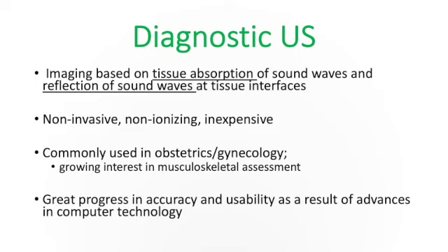We're very commonly aware of this in the context of OBGYN. Obviously, this is a nice way to view what's happening with a developing fetus. And what we're seeing is that with the advances, and especially the advances we're going to see in the live Collaborate session, this has a lot of use.